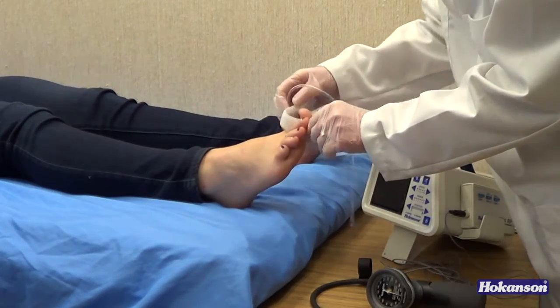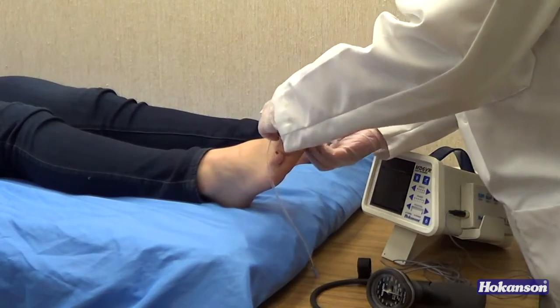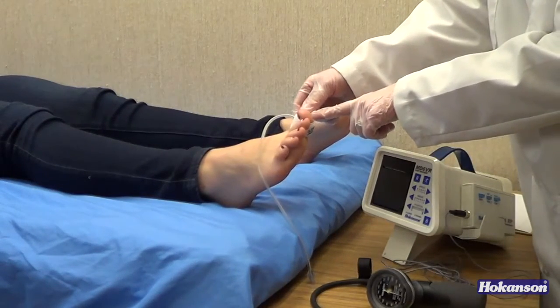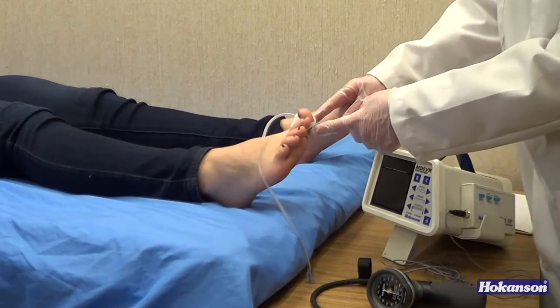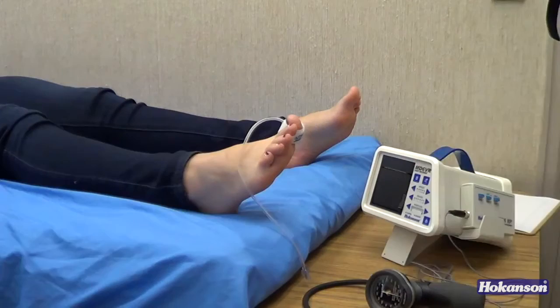Wrap the toe cuff around the toe. It is okay for the toe cuff to overlap itself. It is not okay for it to be too short. Both ends should be overlapping on the toe.